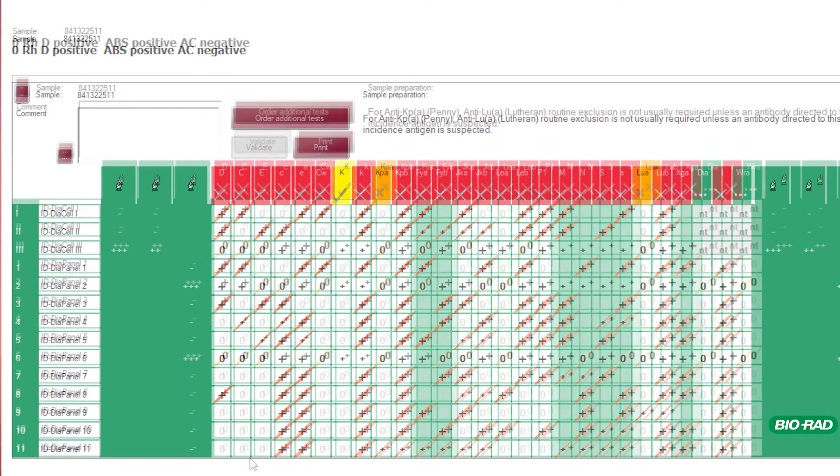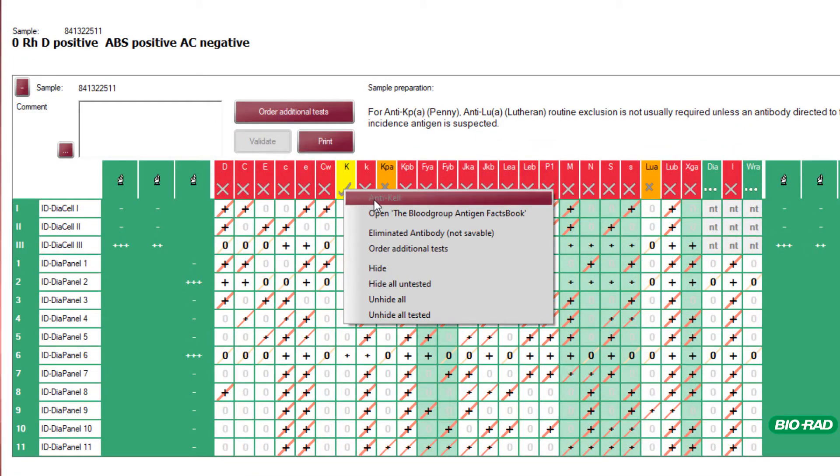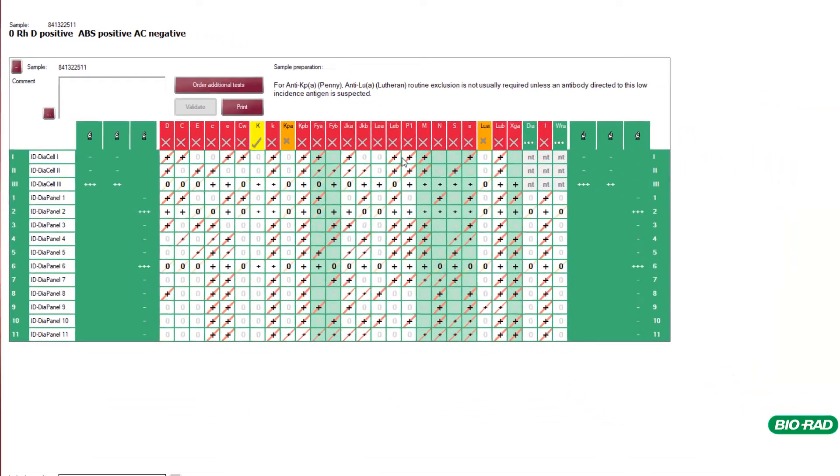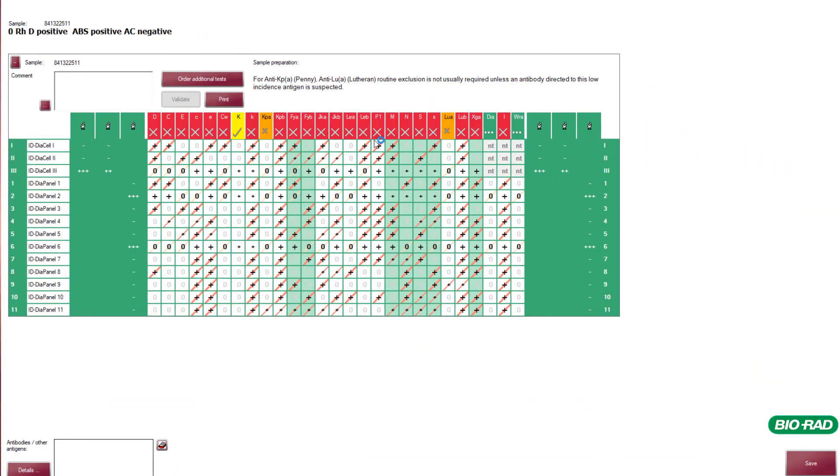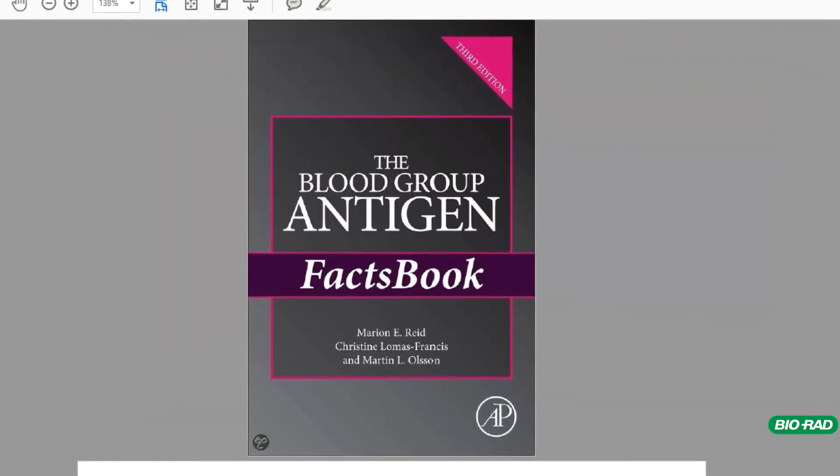The antibody identification software incorporates the blood group antigens fact book. By selecting any of the antigens it will take you to the corresponding page for further reading.